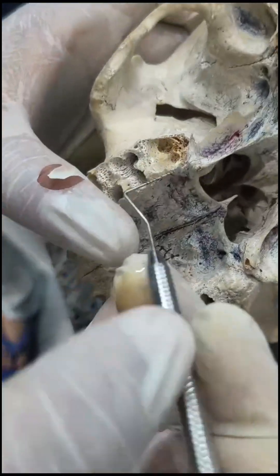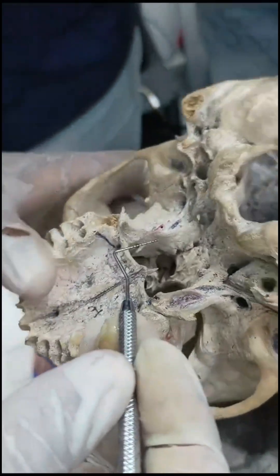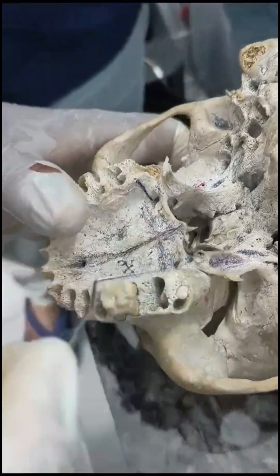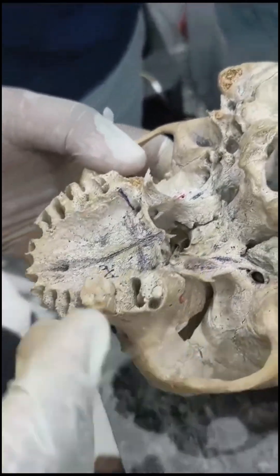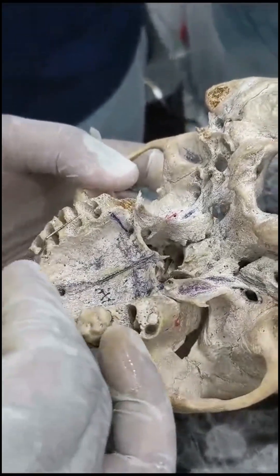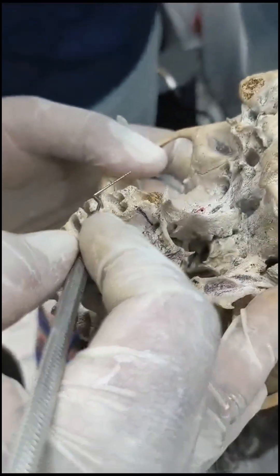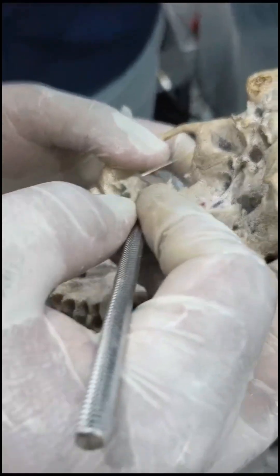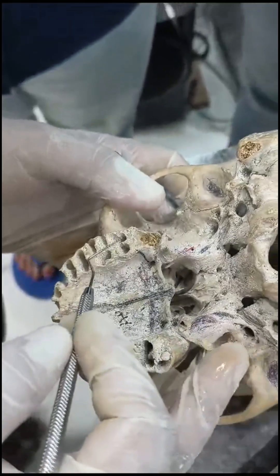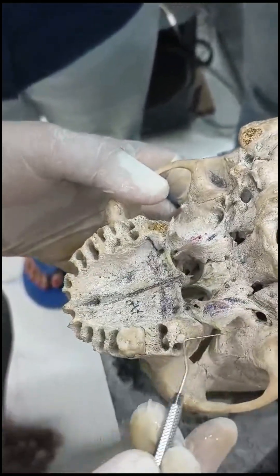We can still go ahead and place the implant. The thing to understand is that if we see the normal arch curvature and follow a straight line, it goes like this — that means there is no way we are engaging the pterygoid plates if we follow the arch.